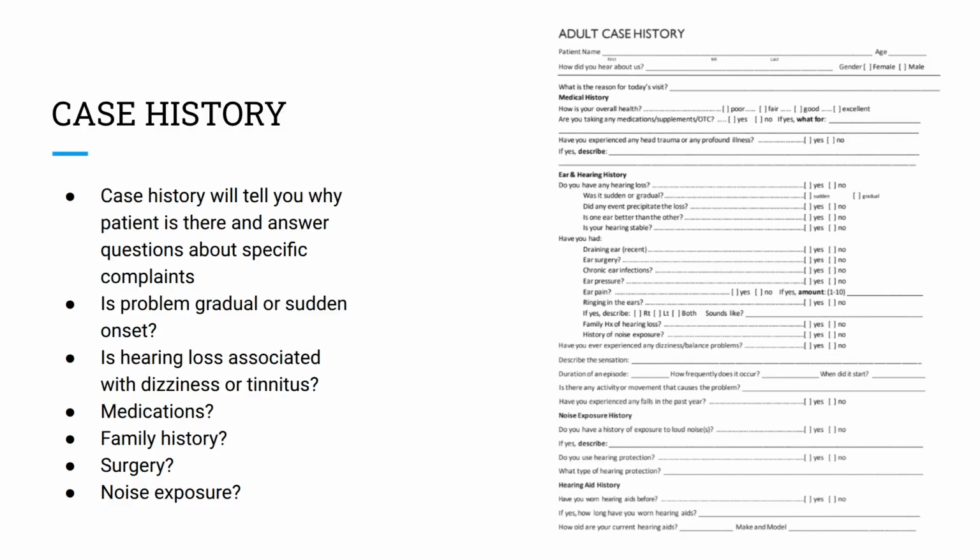Have they had any ear surgeries? Have they had noise exposure? What's the extent of their noise exposure? Have they worn hearing aids? If so, how long have they been wearing hearing aids for? You're also going to find out information about their ear infection history. Do they have complaints of ear pain or aural fullness?